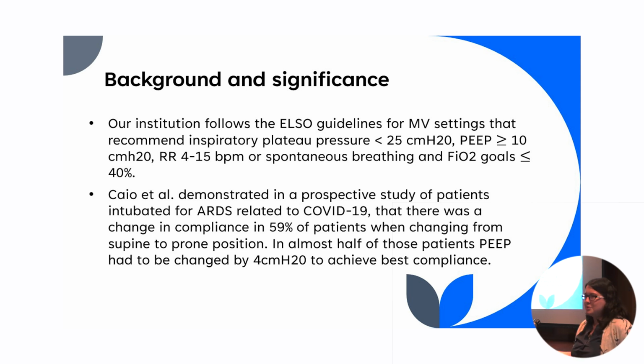Maybe we're not supining and proning people all the time, but even when you rotate patients from left to right, you go in and you're like, wow, they really like their right side today. Don't put them on their left side. Mrs. Smith took 30 minutes to get her sats back up. Just gentle on the left, bring up the right.